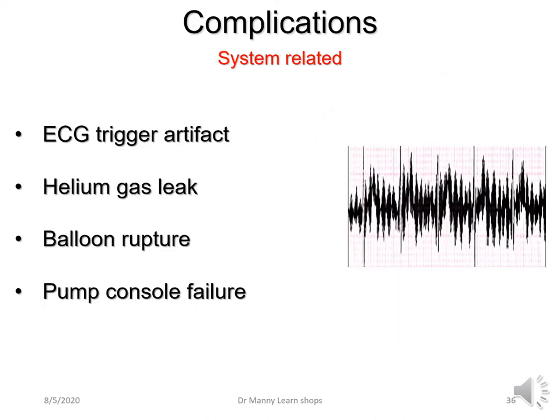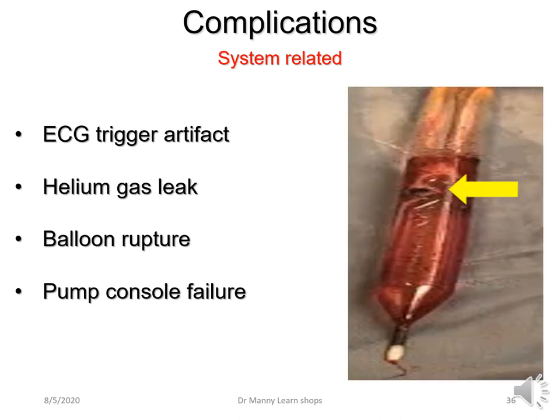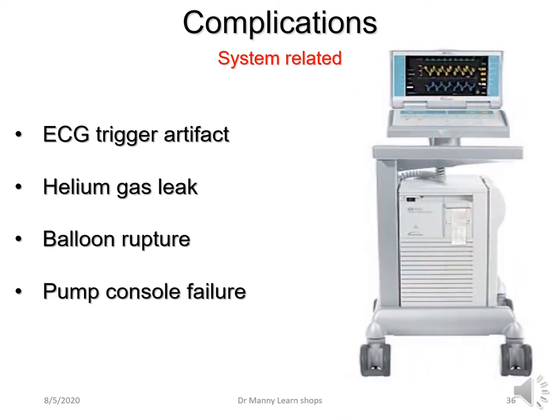Then you've got system-related complications. This can be the result of ECG trigger artifact, which we'll be looking at later on when we look at timing problems. Helium gas leak. The balloon could rupture. Or you could get equipment failure.